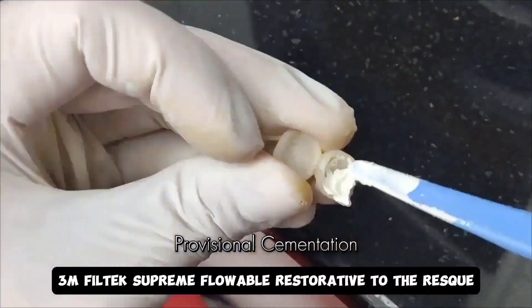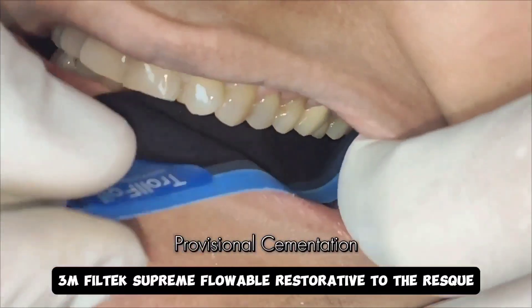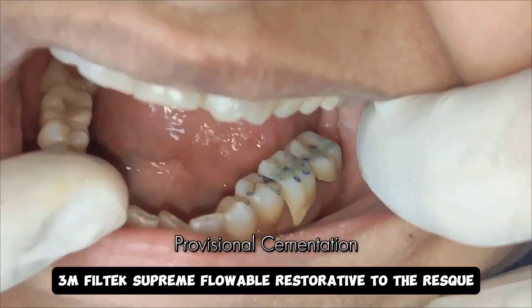Once this is done, I love to cement these with the help of a eugenol-free zinc oxide cement. Once it is set, I'm checking the occlusion, which looks spot on.